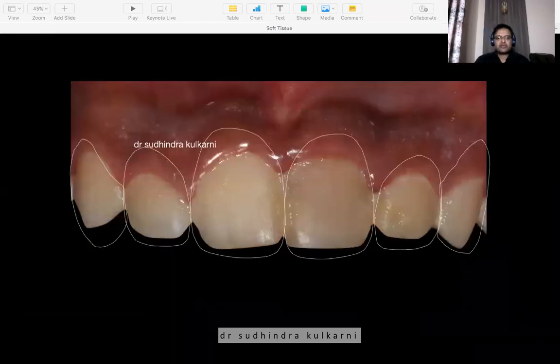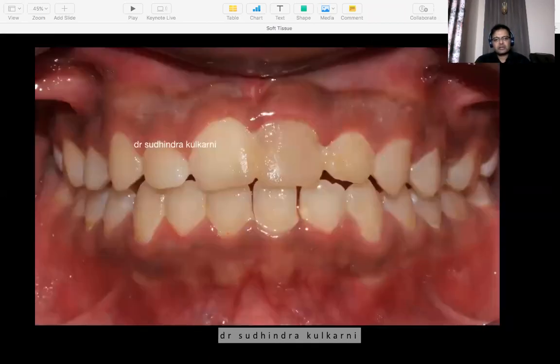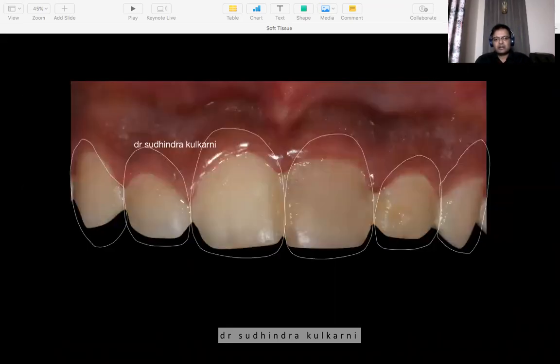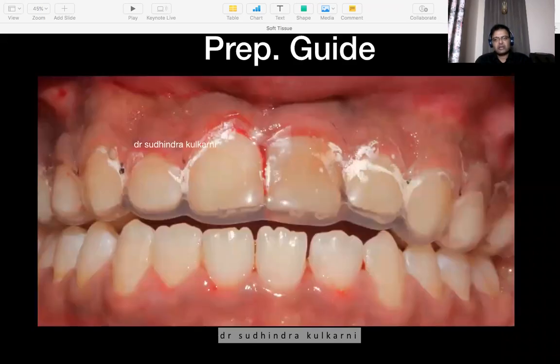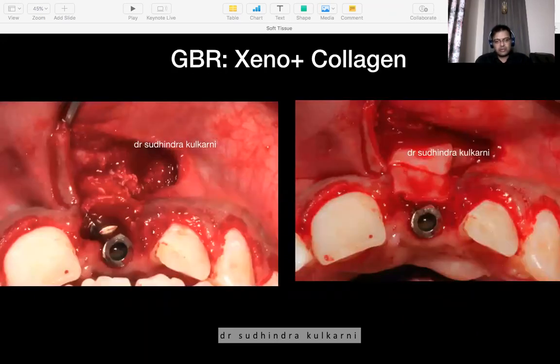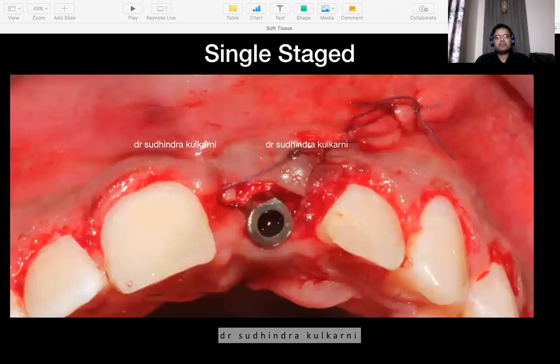So this was an ankylosed 2-1 which was resolved. Okay, that was some soft tissue planning. This patient, a student of mine, had undergone some orthodontics. He had altered passive eruption. So we had to correct the soft tissue height and soft tissue bulk, as well as get the implant in. So we planned the soft tissue reduction first. So we made a template, and as per the template, the soft tissue excision was done. After the soft tissue excision was done, the implant was placed, and some GBR was done.